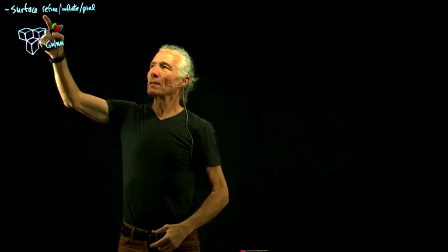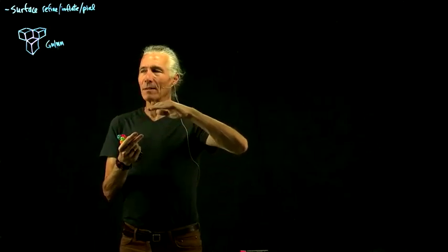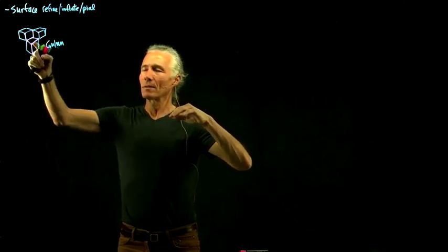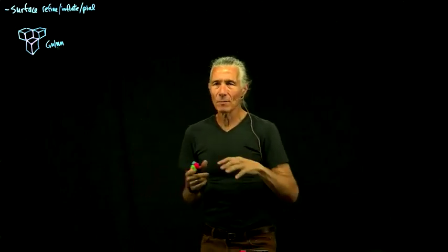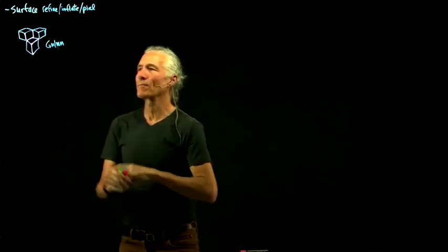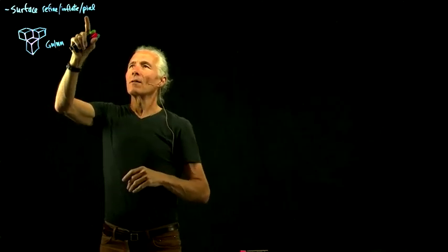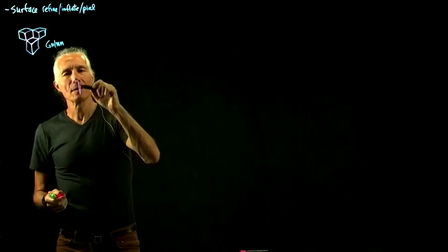So we could make a better estimate, a subvoxel estimate of where the gray white matter surface is, or we could inflate the surface so we can see all the different activity in different parts of it, or flatten it, or try to find the pial surface.